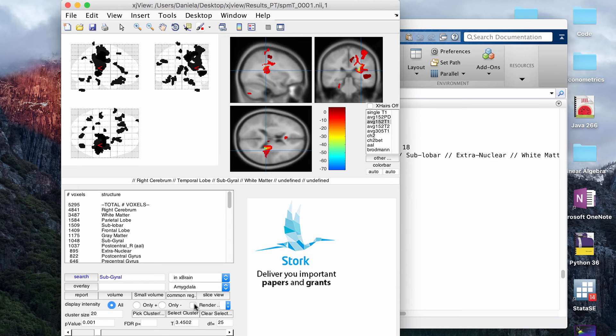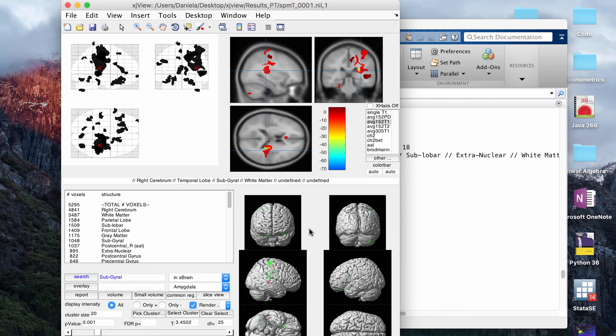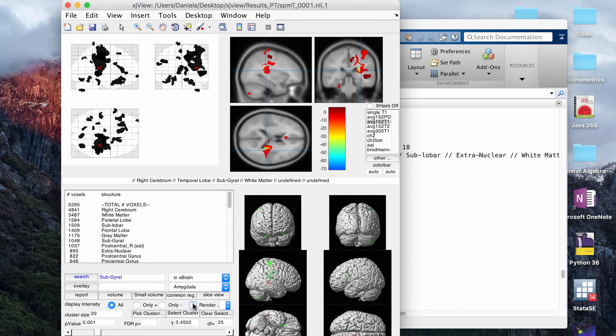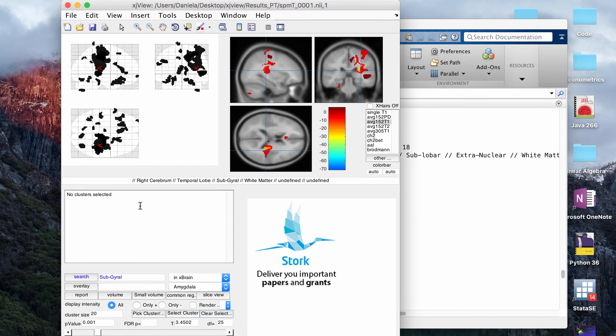This button here, render, it'll just show you kind of a three-dimensional view of the t-map on a brain. I usually don't use that very much, but I guess it could be useful. For this, this clear selection button will just get rid of the information on this window.